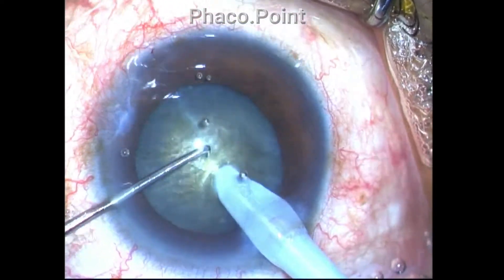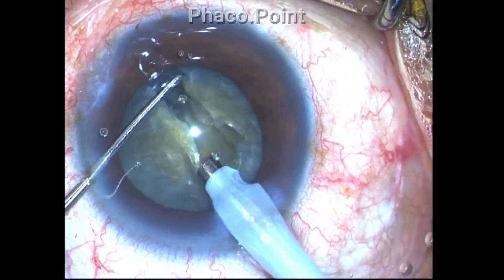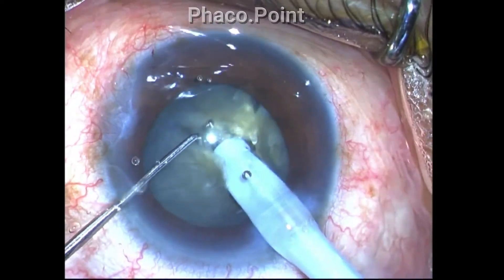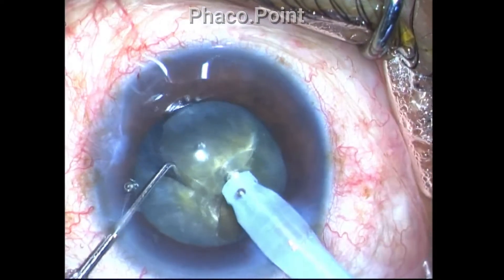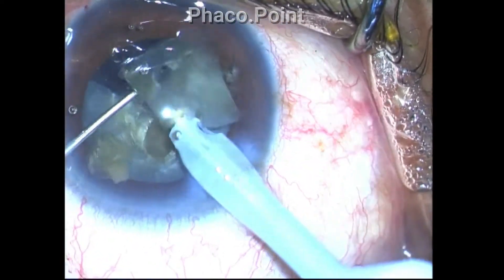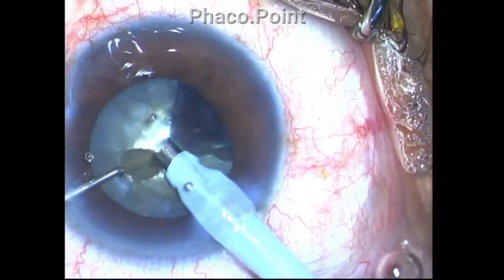One single piece at a time — that's the mantra you have to follow if you want to get clear corneas. Make sure the crack goes through and through, create a small fragment, ensure it is sufficiently freed from the surrounding nucleus, then mobilize this fragment alone and downsize it quickly. Address all the breakaway portions and fragment pieces at one go — do not go to create another fragment until you have completely cleared the anterior chamber of all fragments. Now the anterior chamber is clean; now I go down and take another fragment.